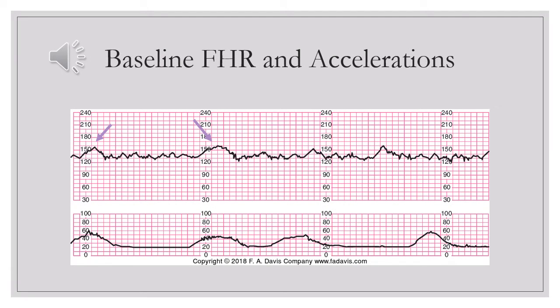This is what your typical fetal heart rate monitor strip looks like. And in this one you can see some accelerations in the fetal heart rate and a couple of uterine contractions.